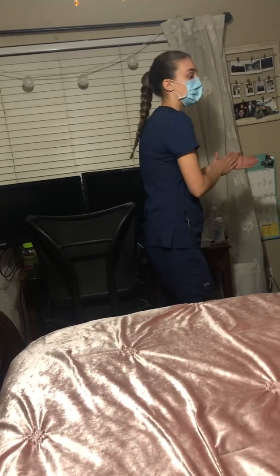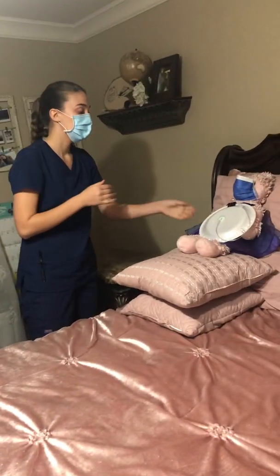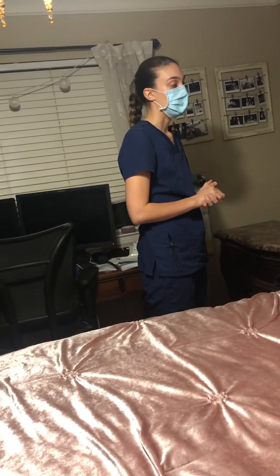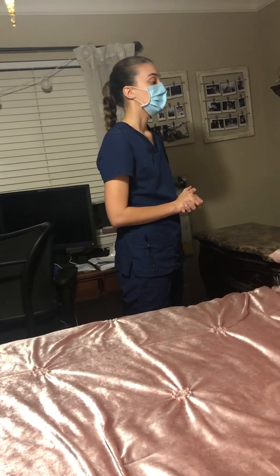Alrighty. Good morning, Mrs. Jones. My name's Lindsay. I'm going to be your nurse today. Can I go ahead and verify your name and date of birth, please? Thank you. Can I also verify any known allergies, especially to the cleaning agent chlorhexidine, tape, or latex? No? Awesome. So today I'm going to be changing your central catheter dressing.